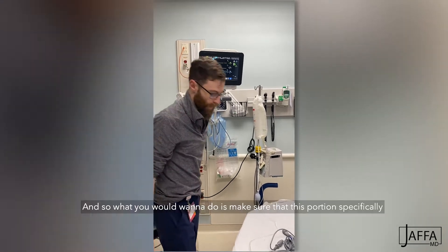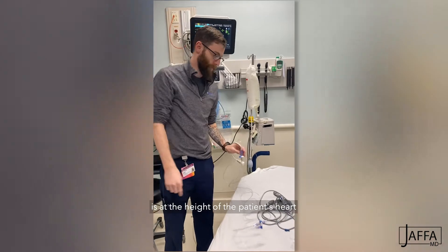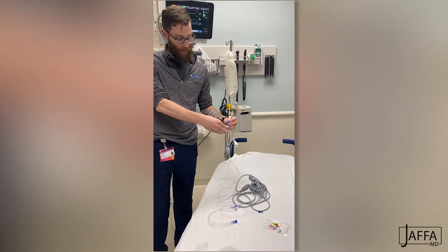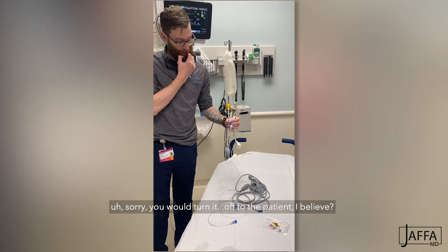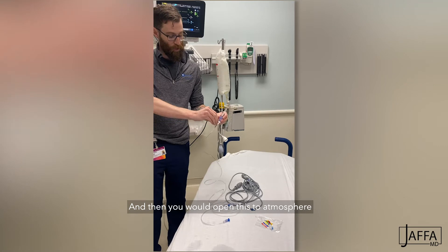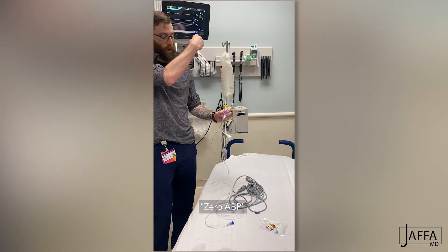When it's connected it'll say 'zero ABP.' What you want to do is make sure that this portion specifically is at the height of the patient's heart. Then you would turn it off to the patient — you have to zero the lines.